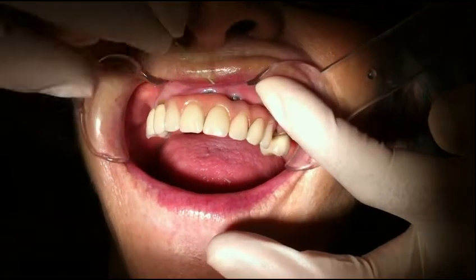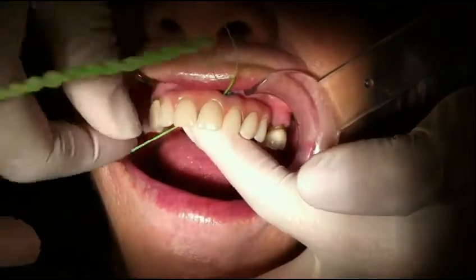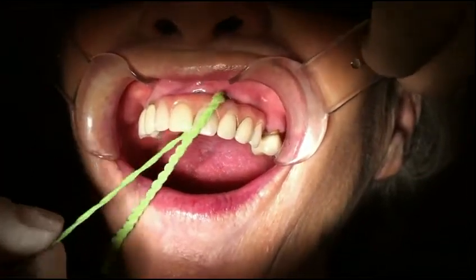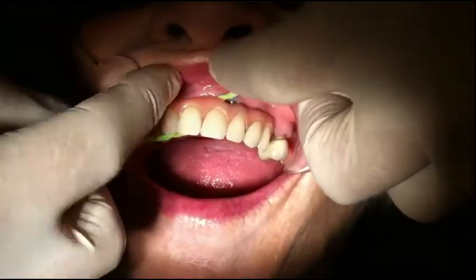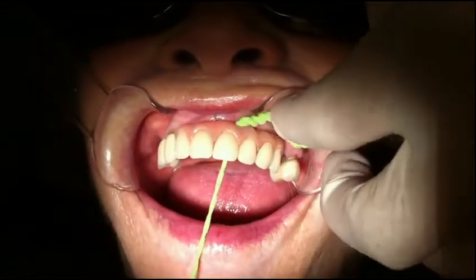Identix X-Floss being used here on an implant denture. The threader passes easily through the deep flanges and pulls the floss through to clean up against the implant. This is especially important where access is difficult.